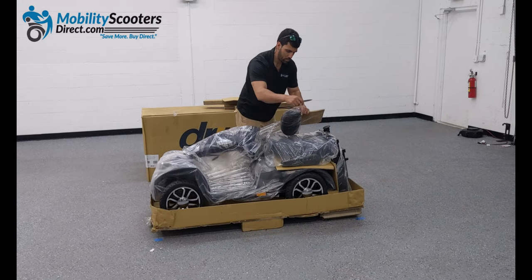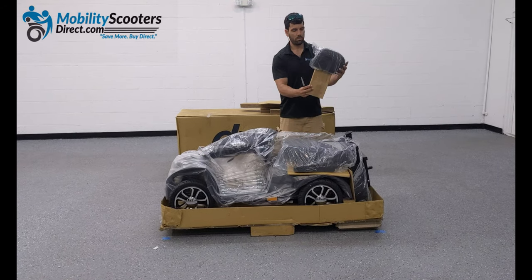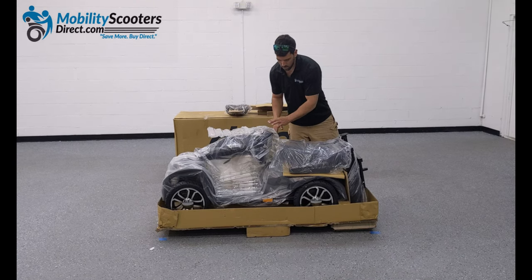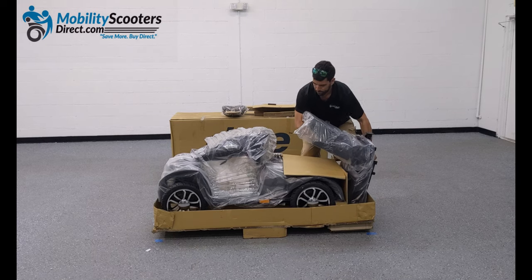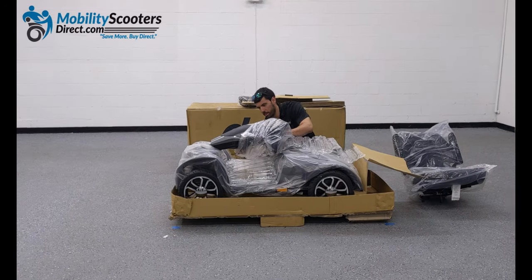Here we're simply cutting away any pieces of tape that are securing plastic or cardboard to the unit itself. We remove the headrest — it was just secured by two pieces of tape — and now we're getting ready to remove the seat from the boxing. Simply pick it up and put it to the side so that it's nice and safe out of the way.